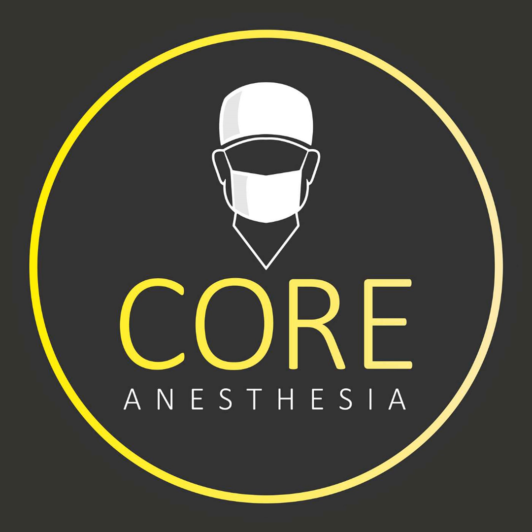The other thing we wanted to mention here quickly is the different technique using a glide scope. So glide scope is going to be another tool you can use specifically if you're into a difficult intubation, if your assessment has shown you that this is going to be a difficult intubation, or you run into an unanticipated difficult intubation and you need a different tool, you can use the glide scope.